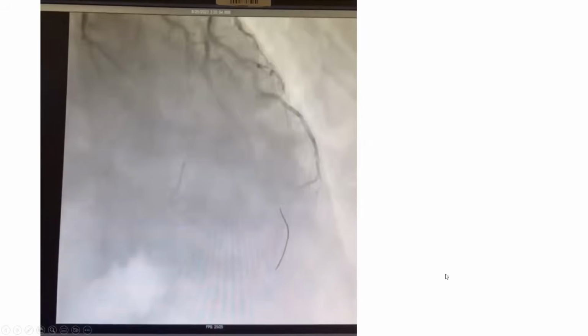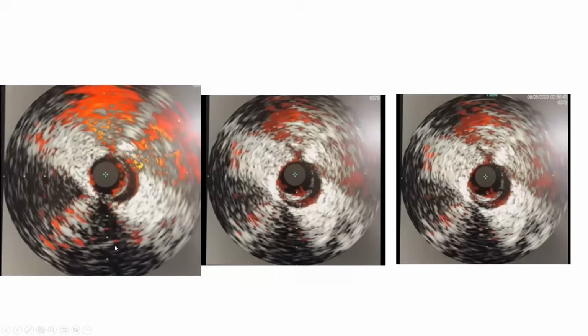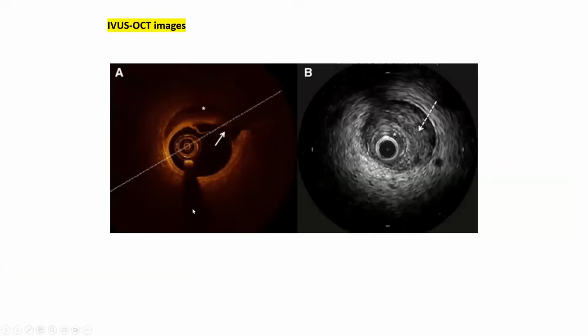And they did something else. Because he's a man and there is a question mark about SCAD, they did IVUS. And I want to show you, Vieussens shared with me, those are excellent IVUS pictures. So you see, this is your IVUS catheter here. They are in the true lumen. And you see here a dark banana shape. That is how SCAD looks. That's how a subintimal plane looks: dark crescent shape or banana shape.